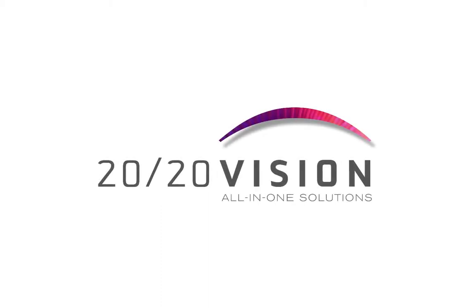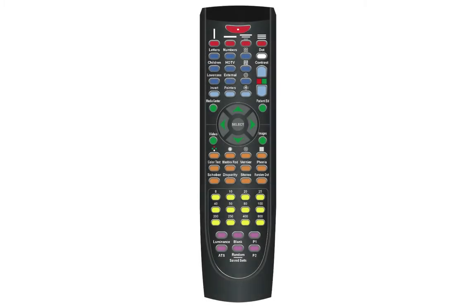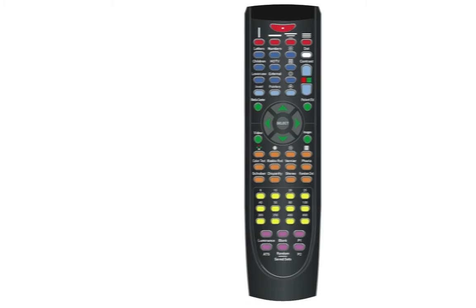2020 Vision was designed to work with our easy-to-use remote control, which you can see here. The remote control is divided into sections that help make vision screening quick and easy.